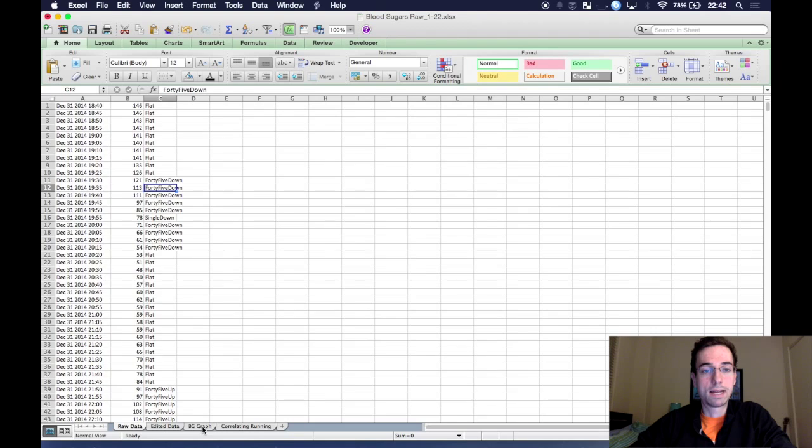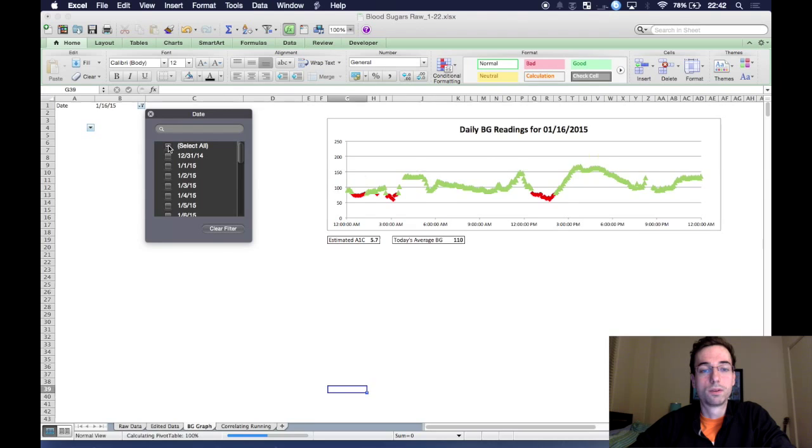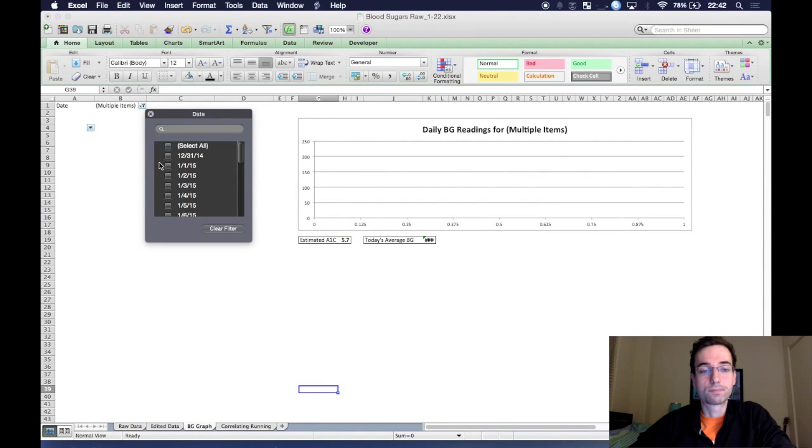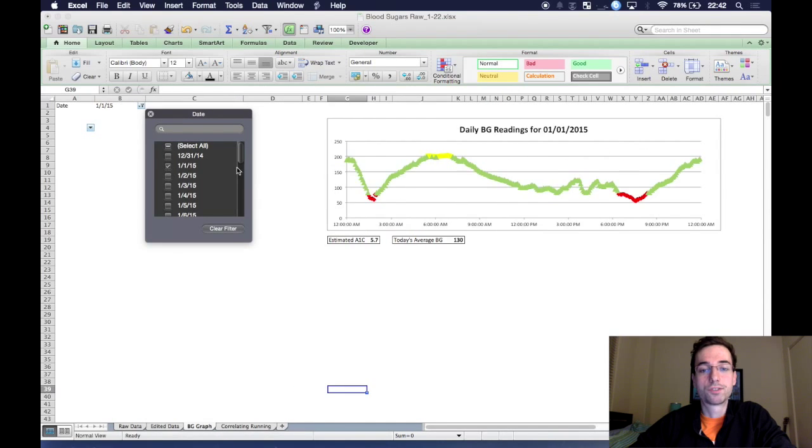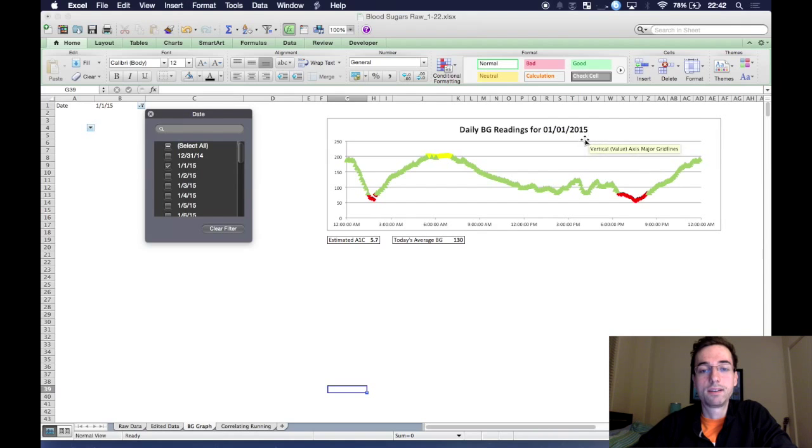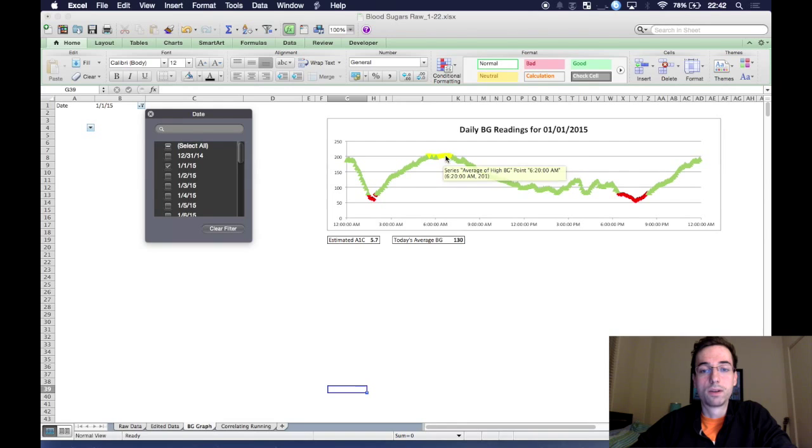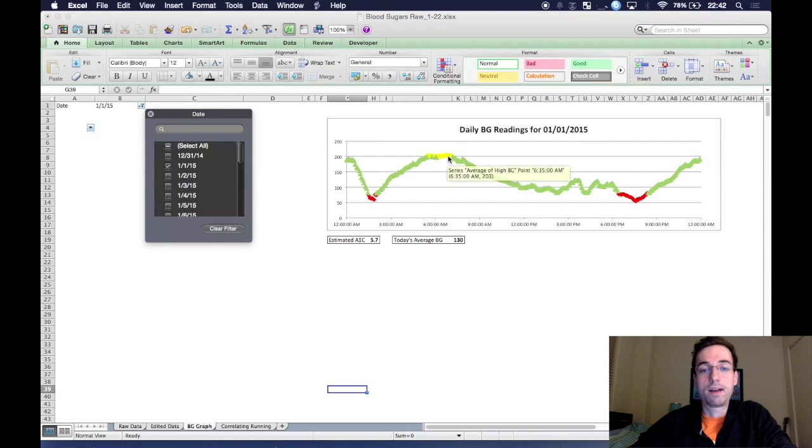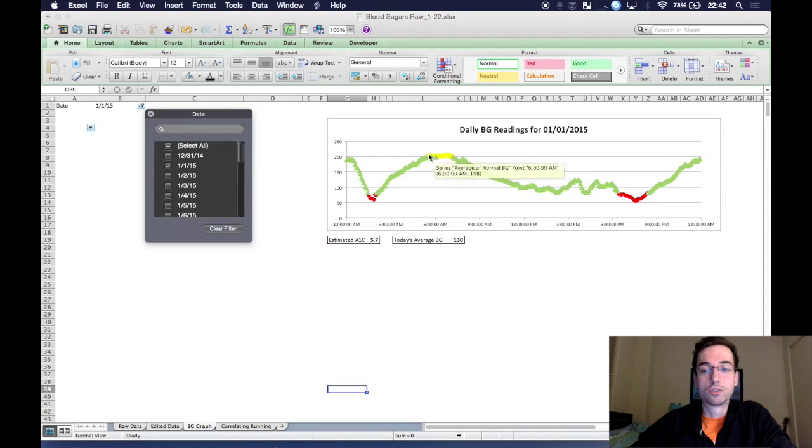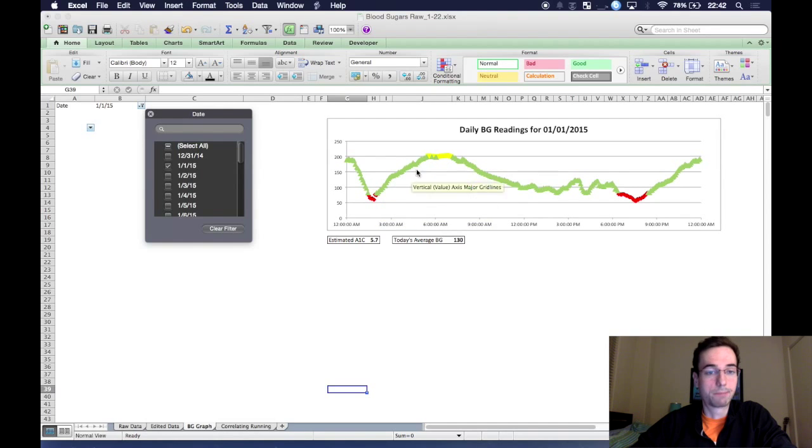And so what I did is I took that data and created a way to see your daily values. So this graph is a 24-hour time chart from midnight to midnight. And then this is for January 1st, 2015. And you can see basically a plot of your blood sugar levels. And it's color-coded. So anything above a set limit of high, so for me I said that it's 200, it shows up as yellow and everything set as low, which I used 80 as my cutoff for low, it comes up as red and everything in between is green.